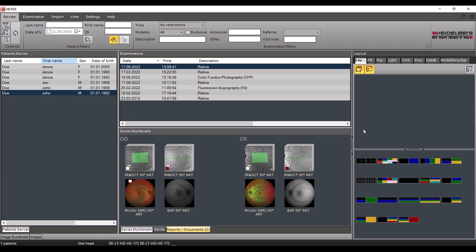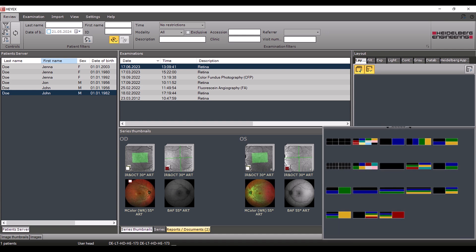In this retina patient, the images of the right and left eye should be displayed simultaneously. Select the Layout tab in the action bar. Here you will find various layouts with different coloured viewports for arranging the image data. Each colour serves as a placeholder for a specific image.